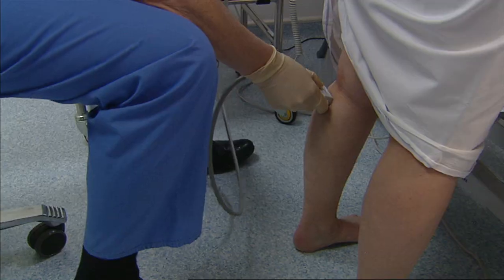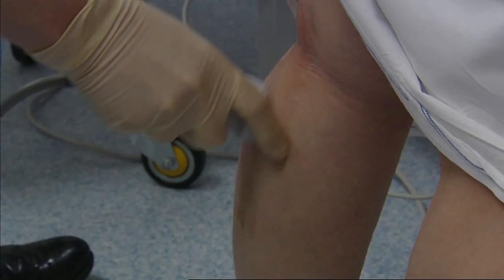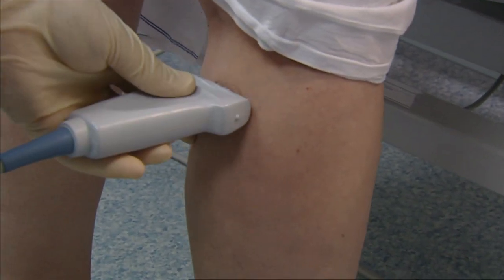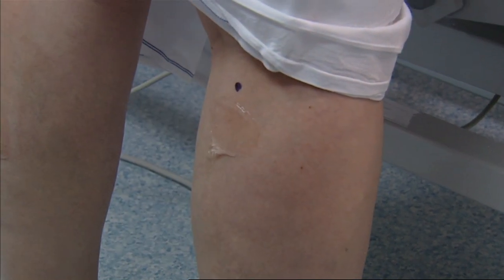Then we use the ultrasound machine to identify the underlying anatomy so that I can decide exactly where I'm going to place the needles in the veins. We're going to put one or two marks on the back of the right leg to help me with the position of the cannulas.